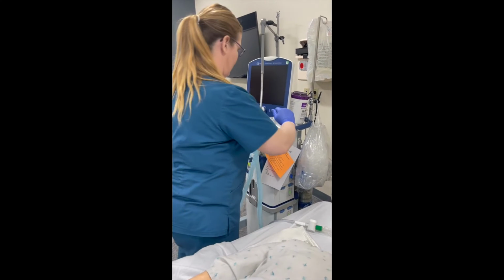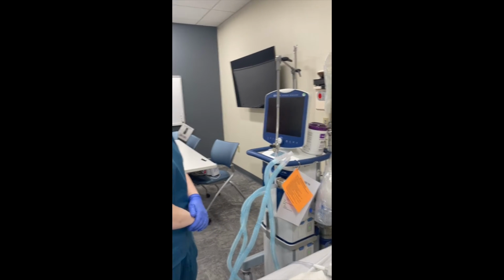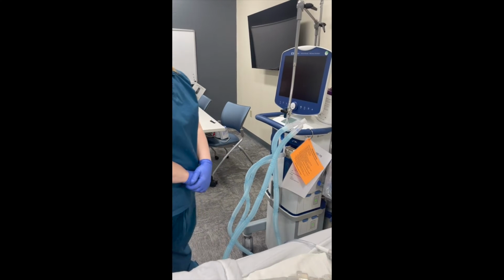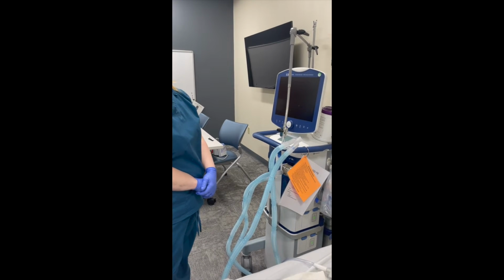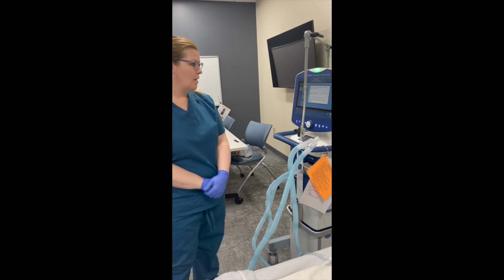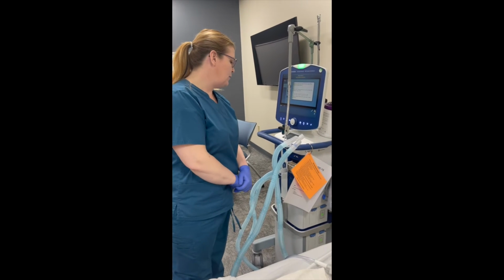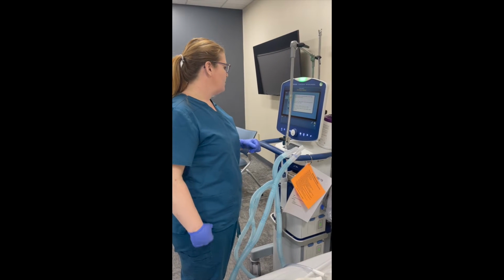Go ahead, disconnect this, turn our vent on. Okay, so our SST was performed. Our SST did pass, so we're gonna go new patient.